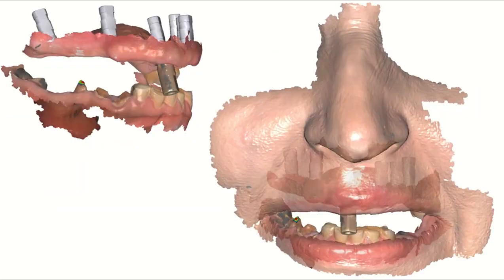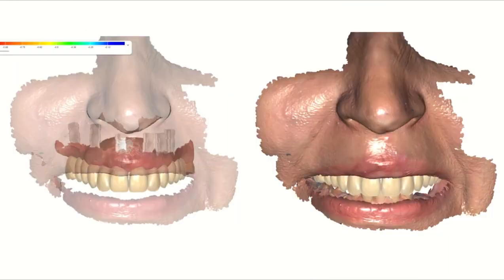Look how the scan body is also used for perfect alignment of the face in completely edentulous cases. Designing the teeth is facially driven, as we said before, respecting the correct occlusal plane orientation. Also, the smile line, the position of the midline and the lip line will all be taken into consideration, as we discussed before.